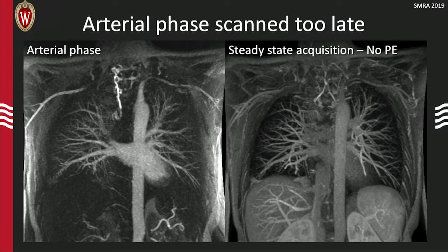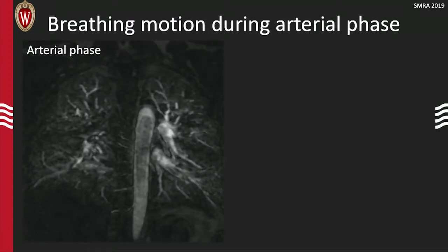Now, we might completely miss the bolus on our first pass acquisition, but that's not a problem with MRA. We just image them subsequent phases later when you're in a steady state after the contrast bolus, and we can get very, very nice images that are, again, diagnostic to the segmental level.